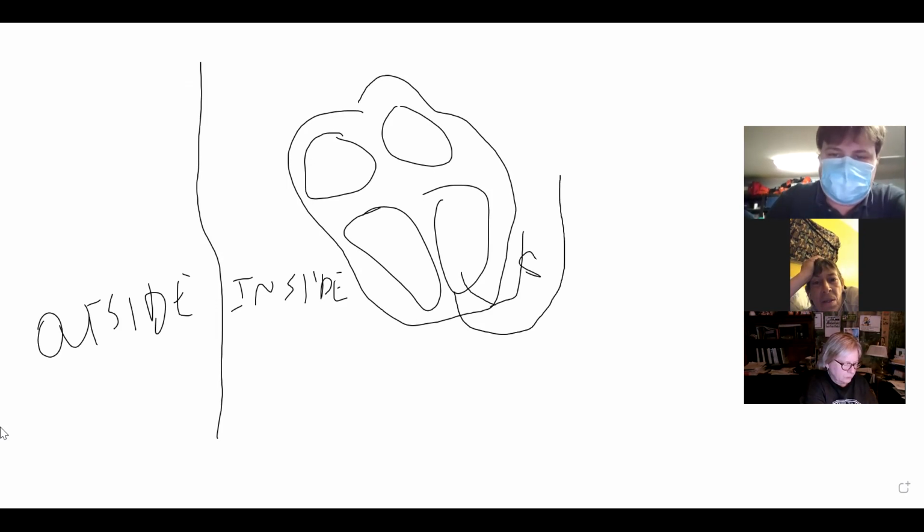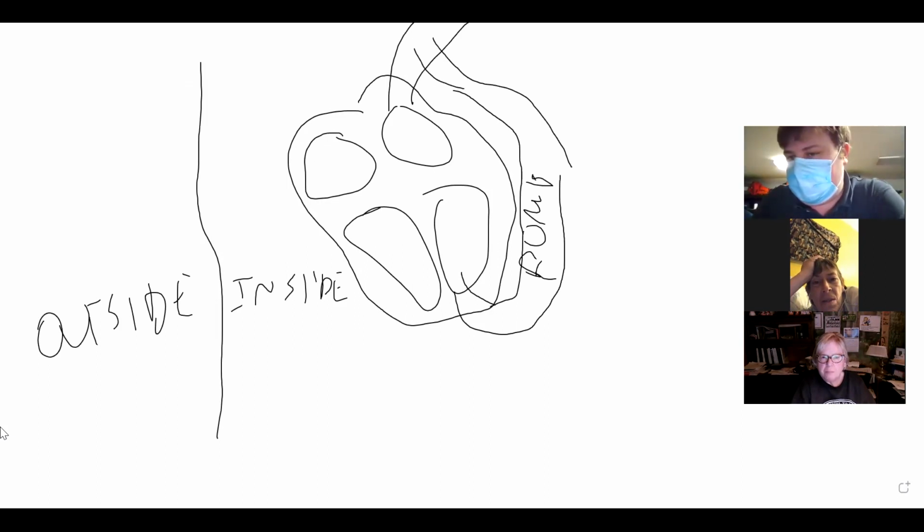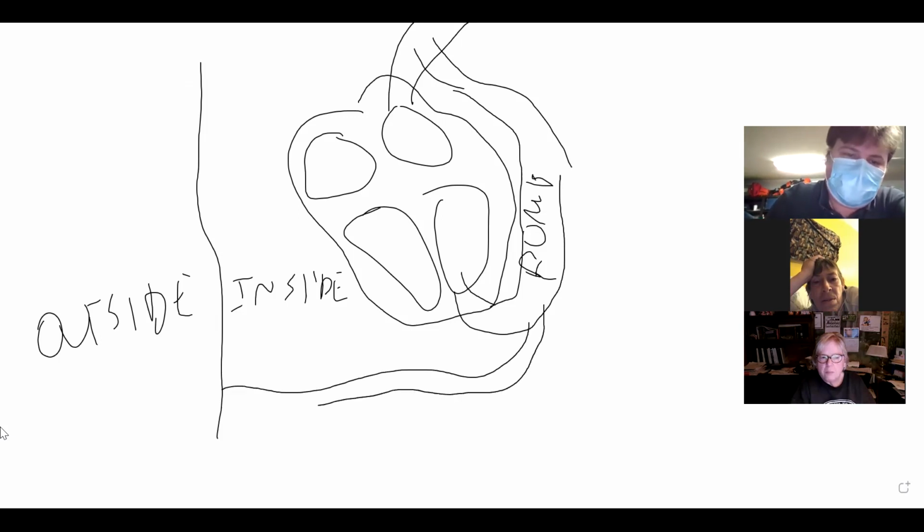We're going to use the left ventricle here because this one usually requires more support. You have the pump, and then out of the left side of the heart comes the aorta. So the pump usually connects somewhere in the aorta just above the point it exits from the heart. You're going to have this wire that connects to the outside that's called a drive line.